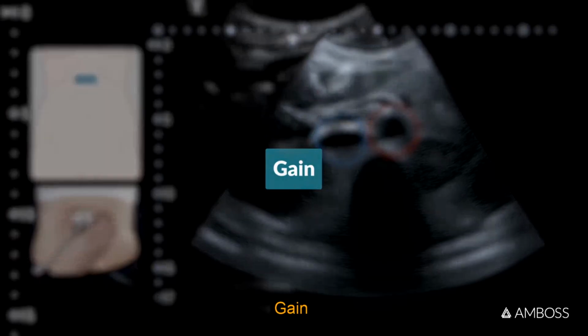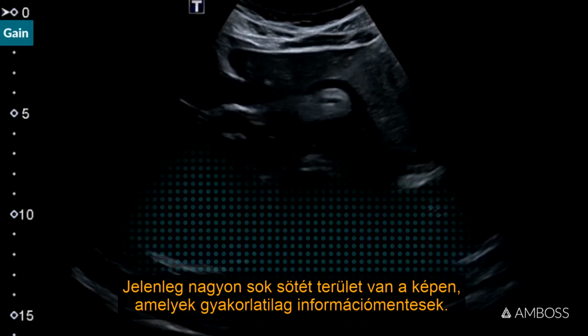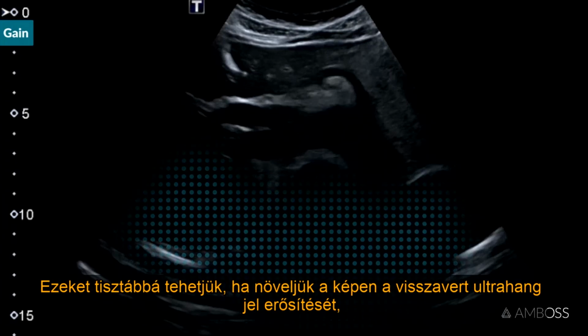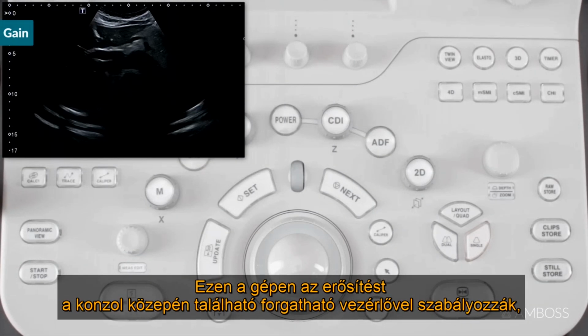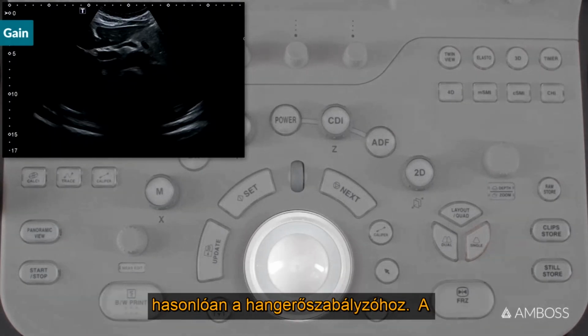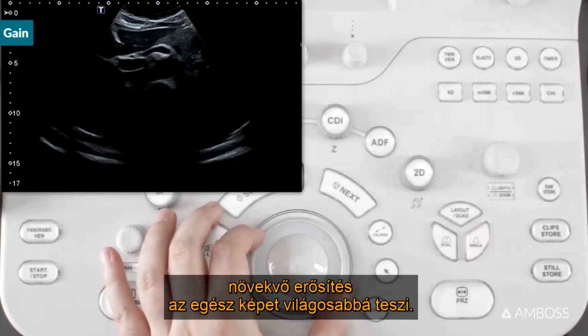Gain. At the moment, there are a lot of dark areas in the image that are effectively information-free. We can make these clearer by increasing the amplification of the reflected ultrasound signal in the image, the so-called gain. On this machine, gain is controlled using a rotary control in the middle of the console, similar to a volume knob. Increasing gain makes the entire image brighter.